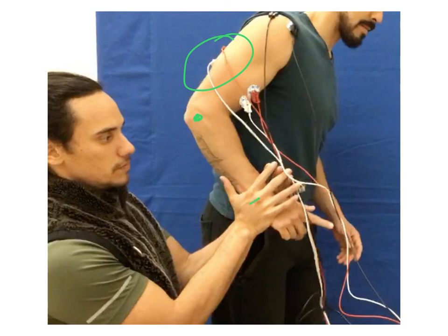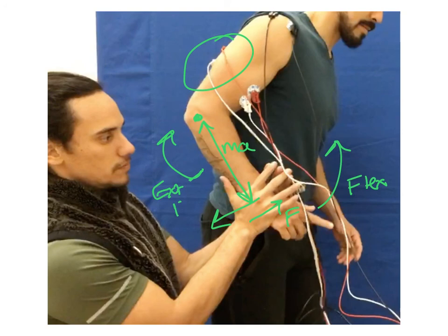So this participant is going to be applying an extensor torque to the maximal effort, and the researcher is going to be applying a resistance here, this force times this moment arm, and that will result in a flexor torque. So the flexor torque is being applied to resist this extensor torque, and everything is to the max.